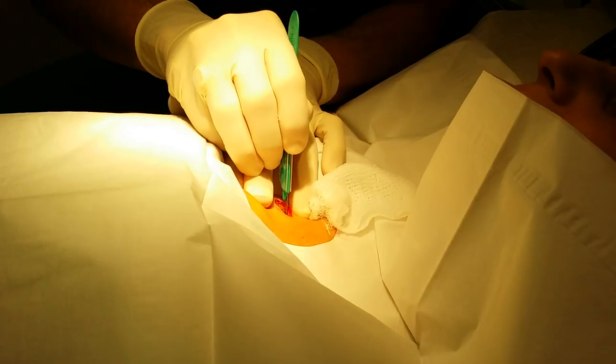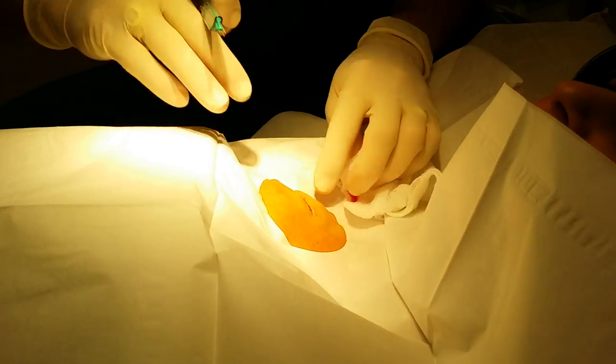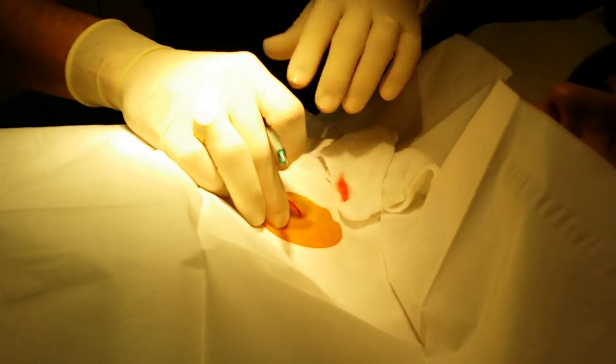Are you going to feel me slicing you open? No, you'll feel some pressure. It's kind of weird to know I'm cutting into you right now, but I really like that I can't feel it. Yeah, the numbing medicine does work.